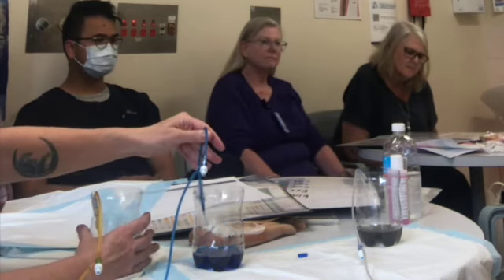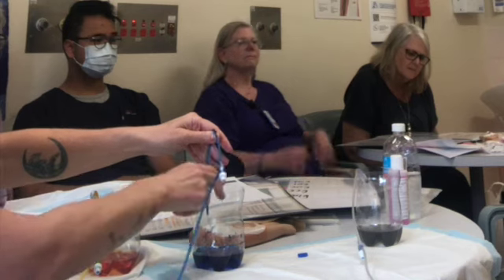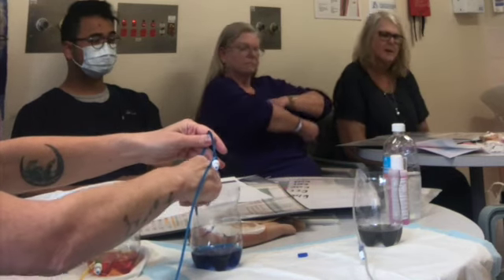When we're giving, now would you say this is a more sort of irritating antibiotic? Definitely something we dilute. We can always clip them off too.